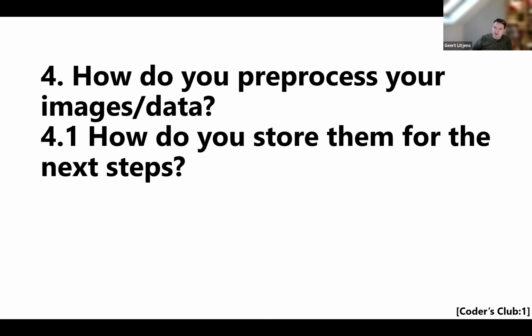Store the data in the format that your deep learning library likes. For TensorFlow, that means sharding it using the TensorFlow Data library. Then it's very easy to profile, see where your bottlenecks are, and make sure that you saturate your IO, saturate your CPU, and that your GPUs can do most of the work. And if you then want to compare 20 architectures, EfficientNet B1 to B9, that goes super fast, and your data pipeline will not be the problem.